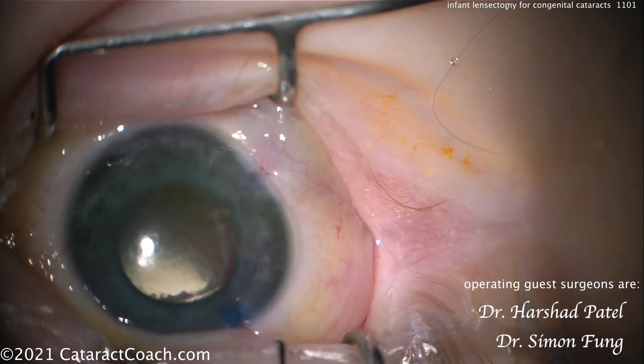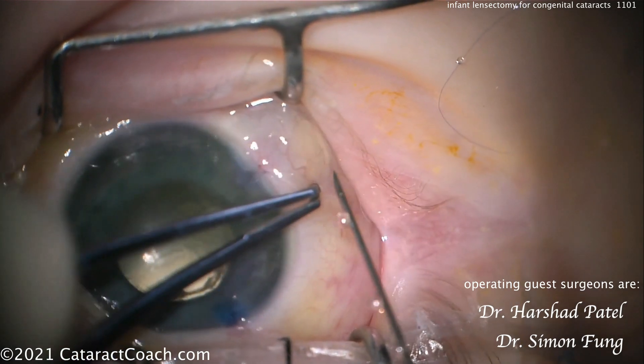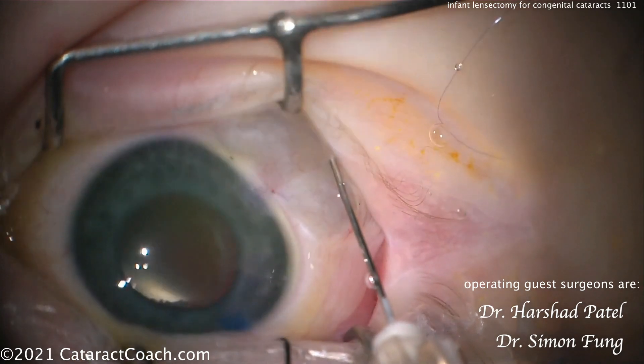At the end, some subconjunctival — maybe sub-Tenon's — antibiotic and steroid. That looks pretty darn good. Beautiful result. Thank you for sharing this video. Always a pleasure to have you contribute to CataractCoach.com.